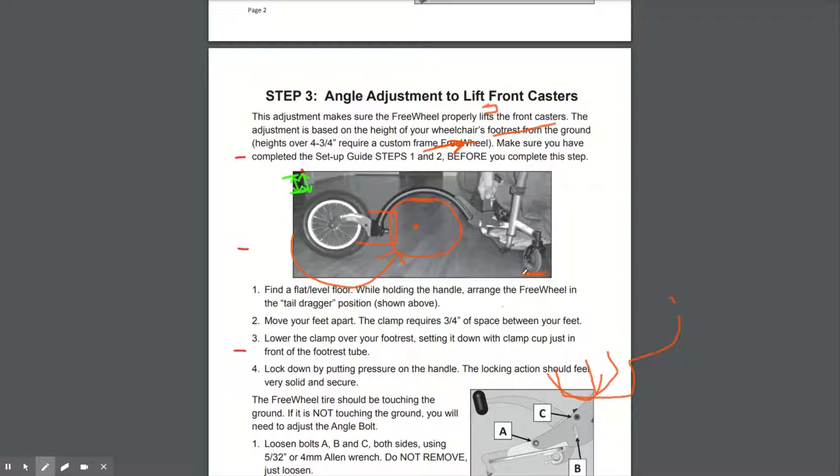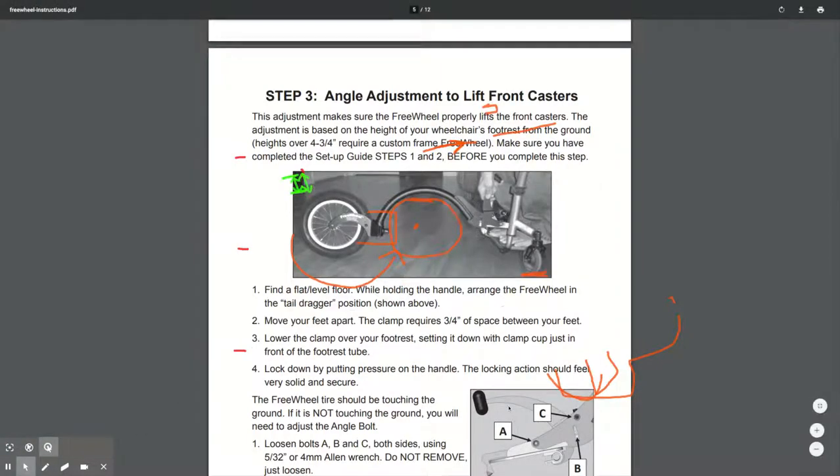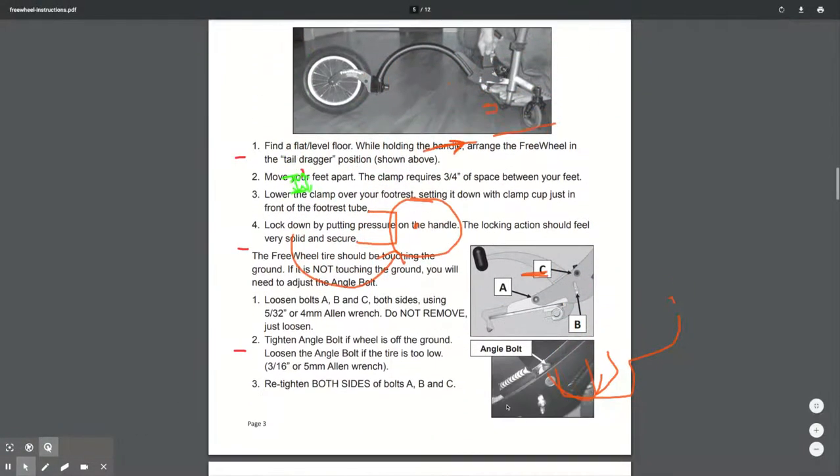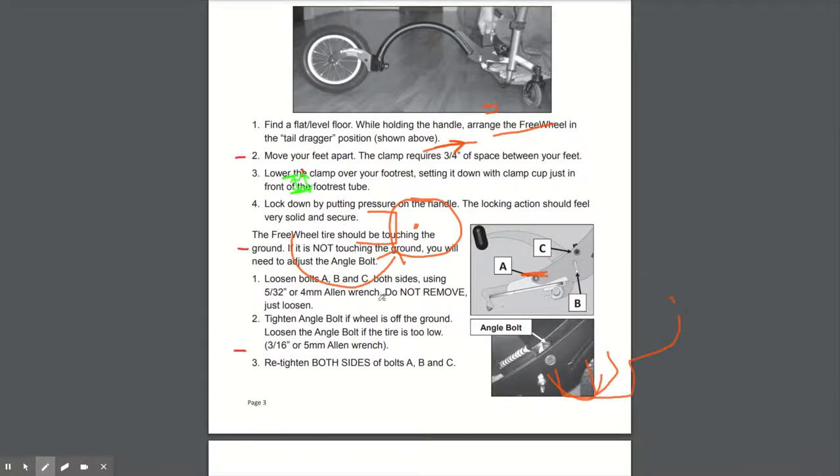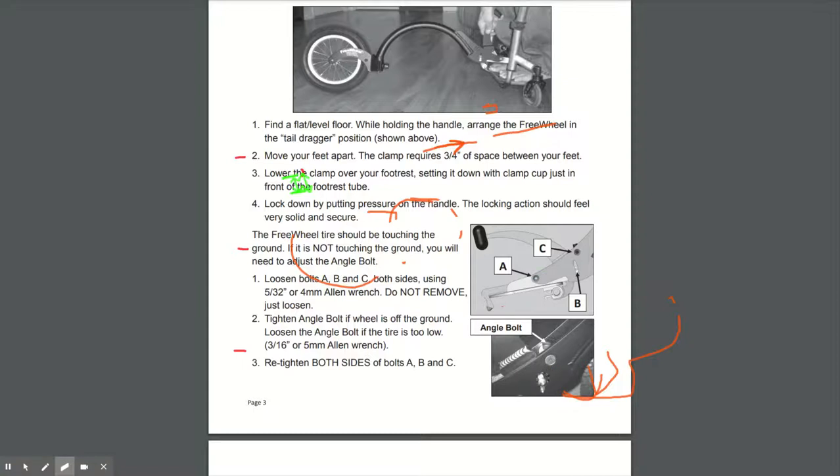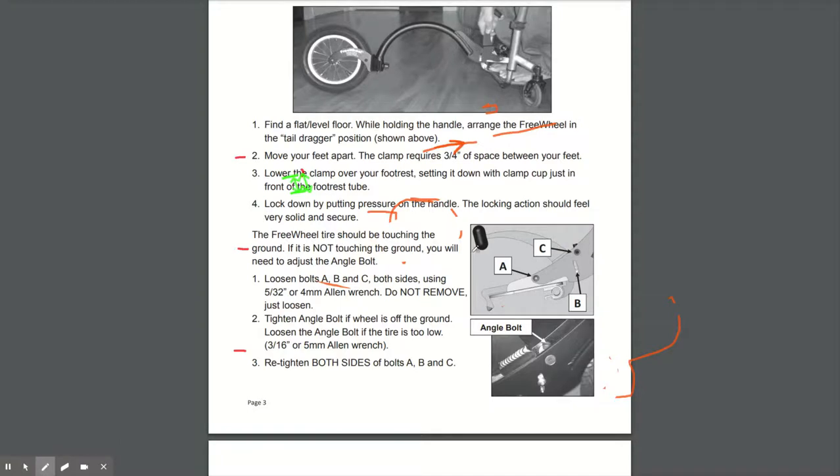that's what makes the wheels come off the floor to caster wheel. So A, B, and C is what's needed to adjust that. So if you follow the instructions here and adjust A, B, and C so that when you fit the freewheel in the tail position, this touches the floor.